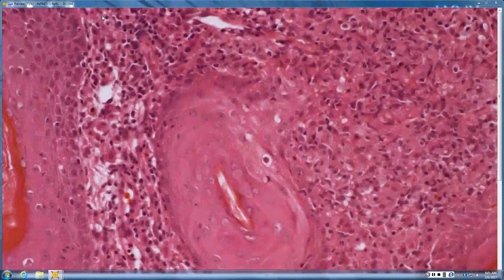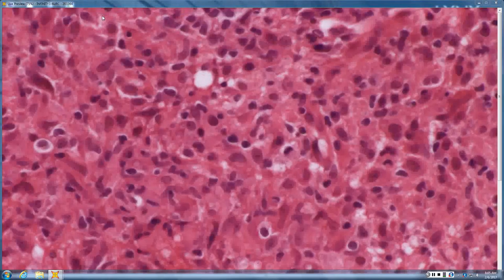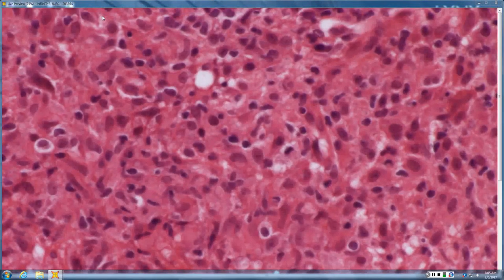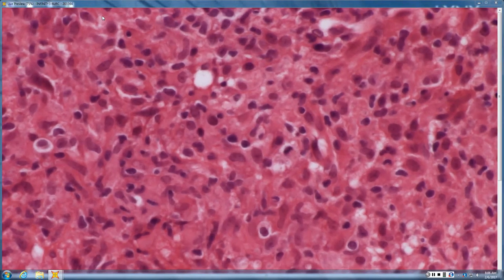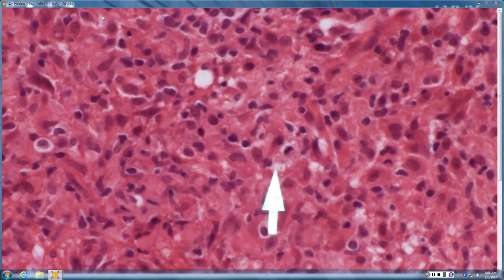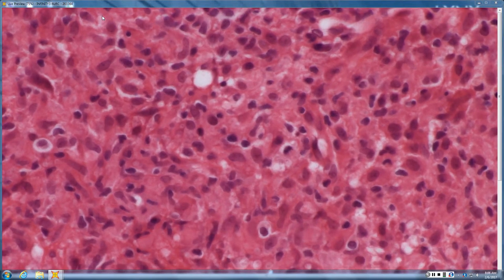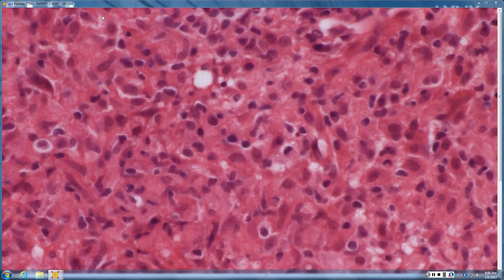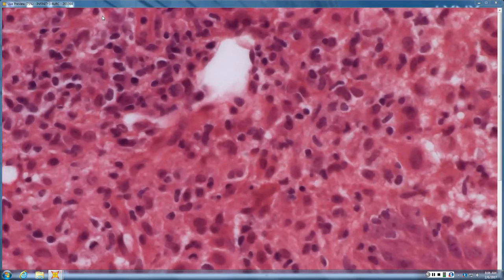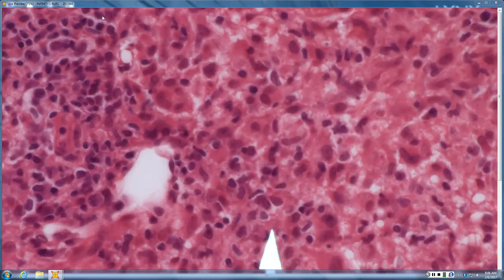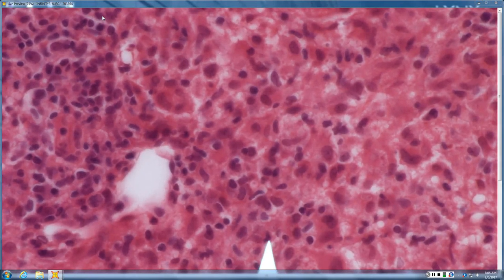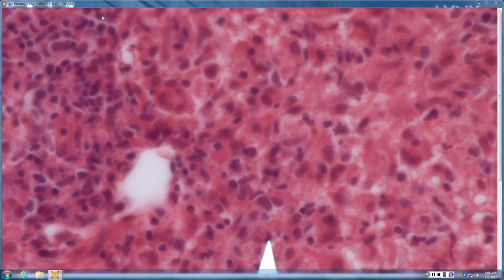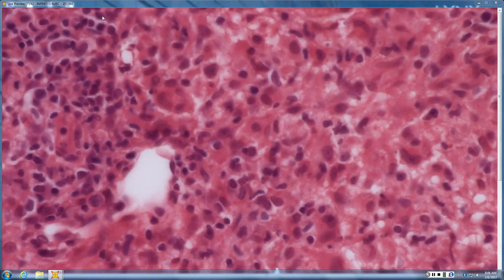So, I see a little small organism. So, and the organisms are within giant cells, pustules, or histiocytes? Looks like they're in the cytoplasm of histiocytes. So, they're within histiocytes, cytoplasm. Yeah, really, there's a lot of variation in size and shape and everything. The organisms are within cryptos. So, that would make you worry about gelatinous cryptos when there's a lot of variation in size.